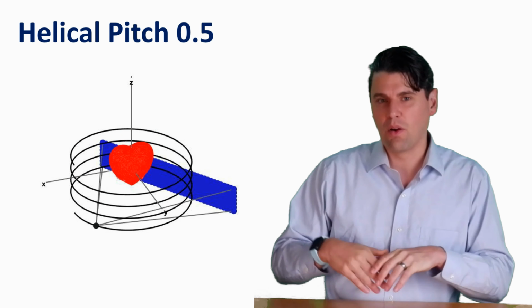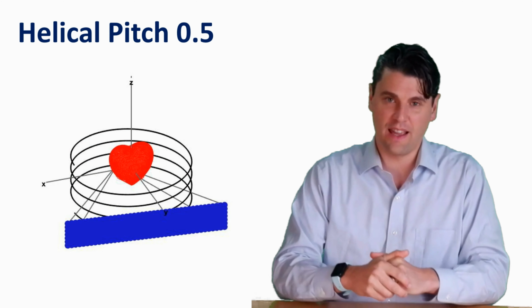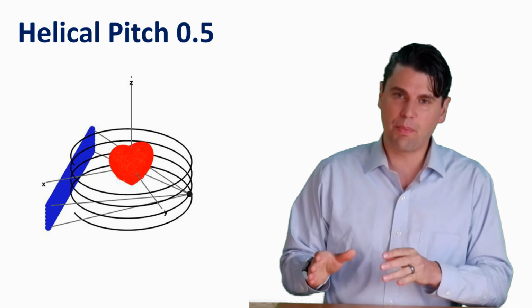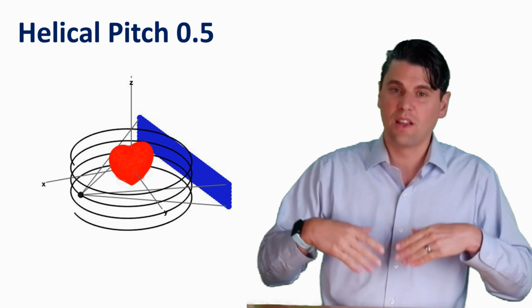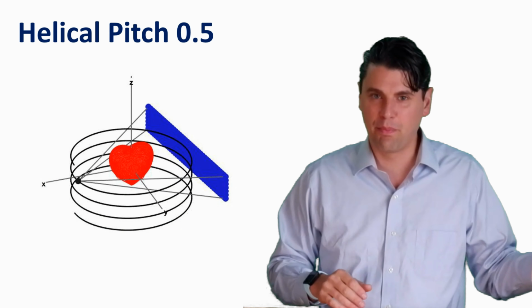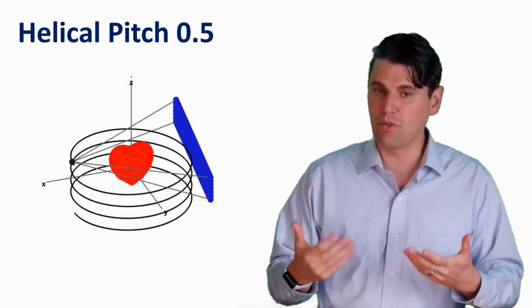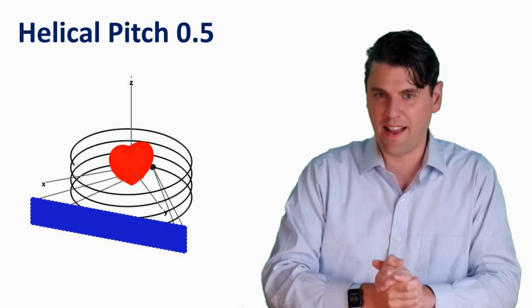And for the task when you actually want to deposit a little bit more dose, you might want to use a case like this. If you want to have the same dose, it's definitely possible that going from pitch 1 to pitch 0.5, you can adjust the mA, adjust the rotation time. So changing from pitch 1 to pitch 0.5 does lead to roughly a factor of 2 dose increase, but you can compensate for that by changing the other factors.